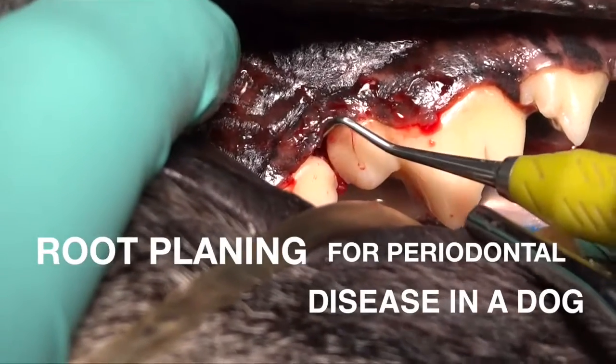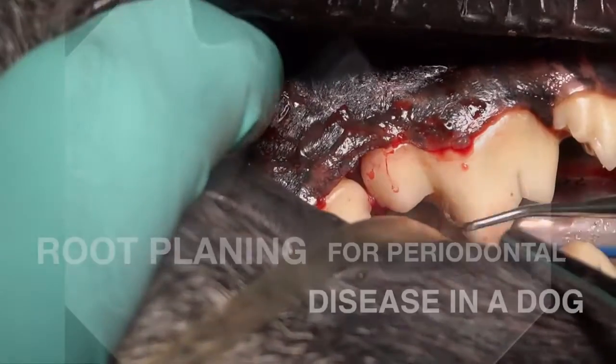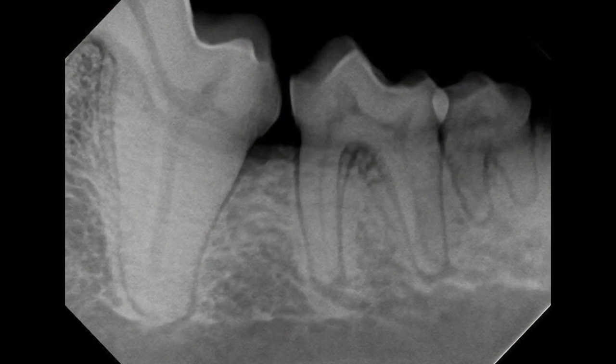In this video, we're going to demonstrate root planing for a very small periodontal defect adjacent to the first molar on the left mandible in this dog. If you look at that arrow, you can see right adjacent to the distal aspect of that tooth, the bone has a decrease in density that's very minor.